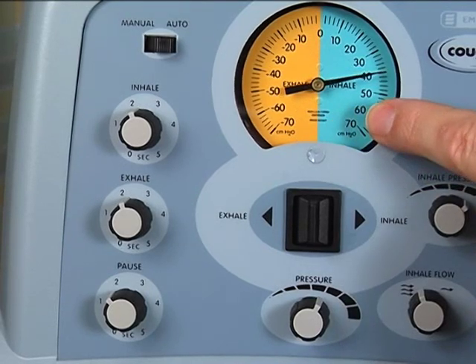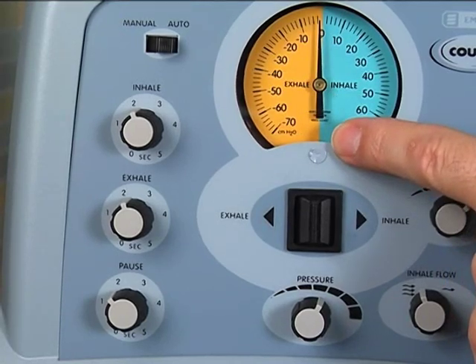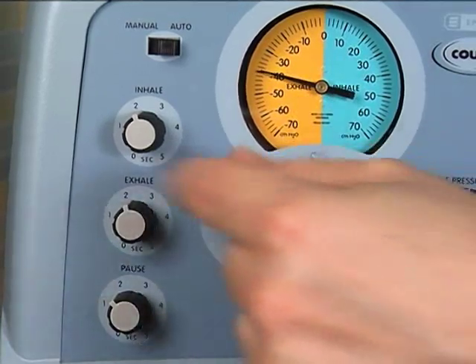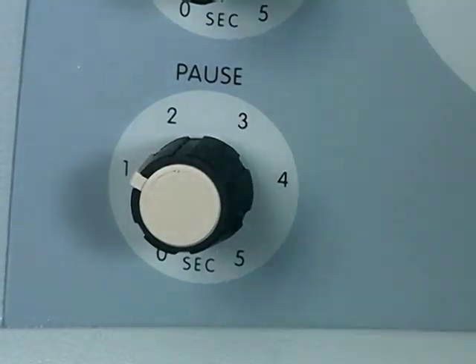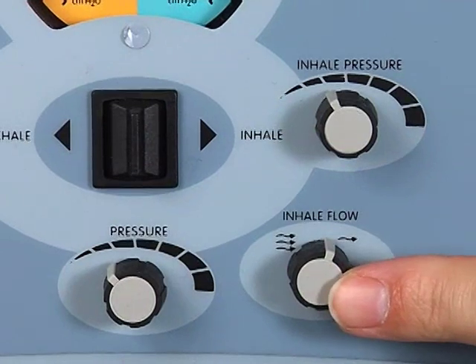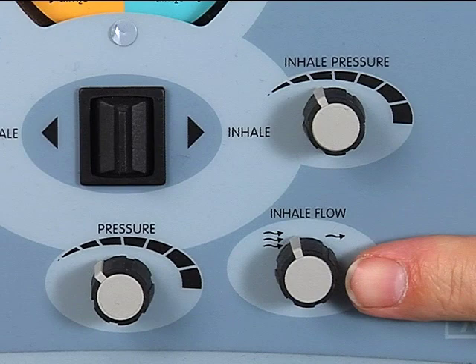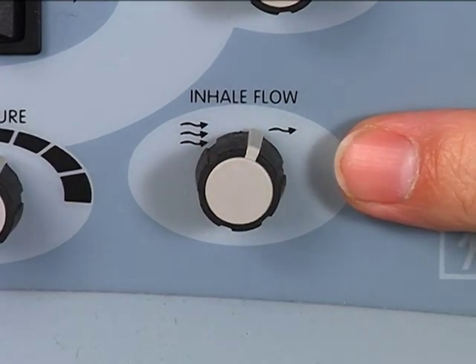Each phase of breathing should be set so that you can get the air in and out of your lungs comfortably, and then pause to continue coughing if needed. Set the inhale time knob at one second, the exhale time at one second, and the pause time knob at two seconds. Set the inhale flow knob at the squiggly arrows or full flow. If you feel too much air flow coming from the machine when you take a breath in, you can decrease the inhale flow from full — three squiggly arrows — to reduced, one arrow.